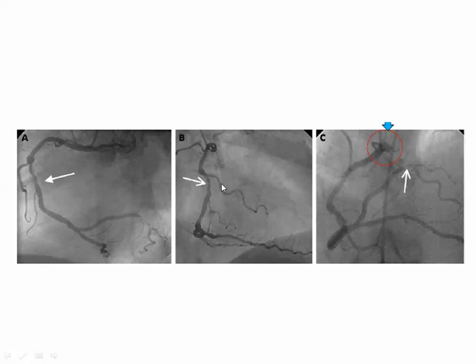Okay. And this is what? SA node. And this, the first going to the RVOT and the pulmonary, just below the pulmonary valve. Conus. The conus is the RVOT. Okay. The outflow tract is termed conus. All the first branch. So it's the conus and this is the SA nodal branch. Okay. This is the RV.